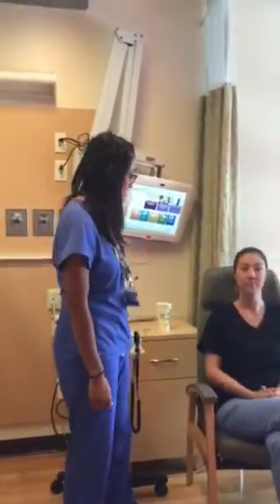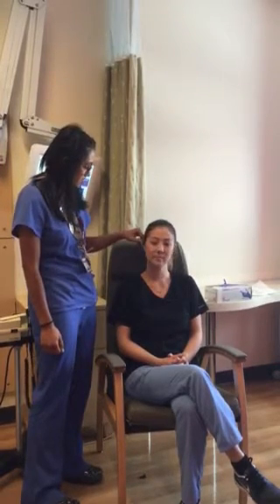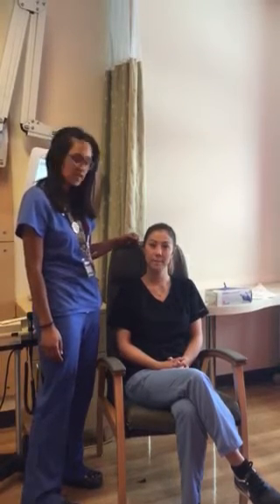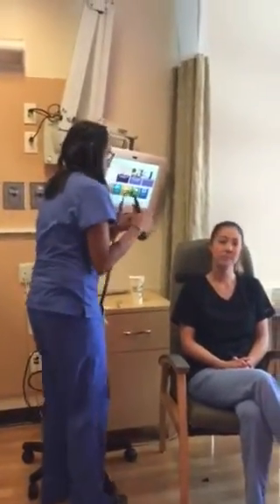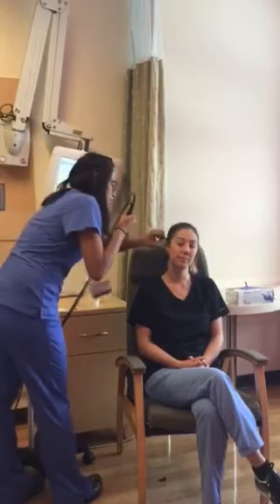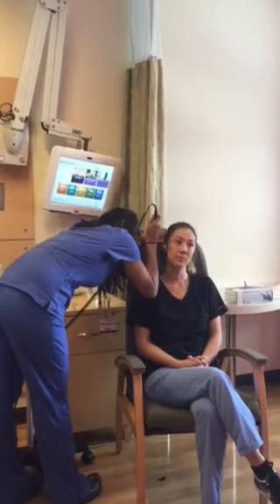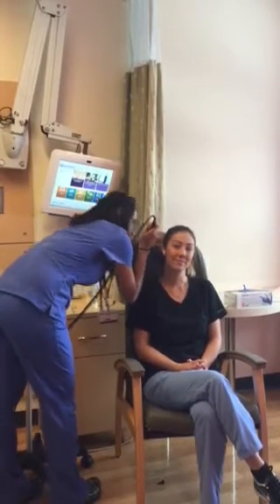So now I'm going to check Tiffany's ear. So you're going to look at her ear, at your patient's ear, look for any redness, any swelling, any deformities, any discharge. She doesn't have any of that. So now I'm going to palpate the pinna. Any tenderness? There's no tenderness, and you want to do that before you check it with the otoscope. So I'm going to get my otoscope here, brace it with my right hand so I can use it to keep it in place. Pull up and back on the ear, and then I'm going to visualize the tympanic membrane, and that should be pearly gray, which it is.